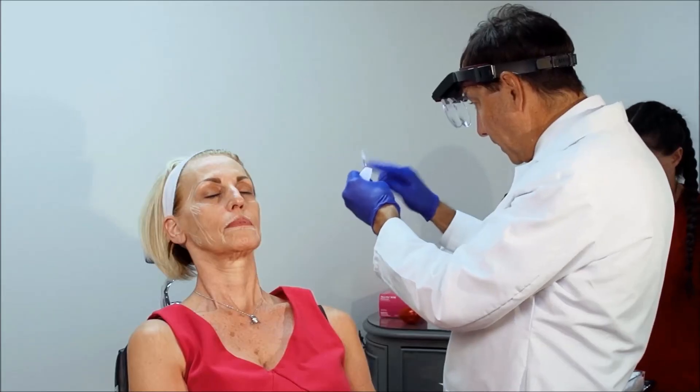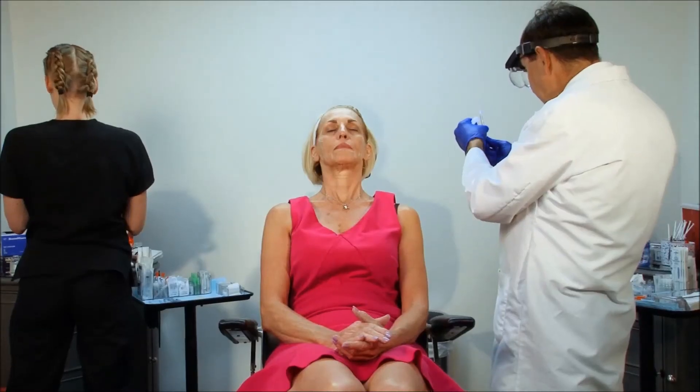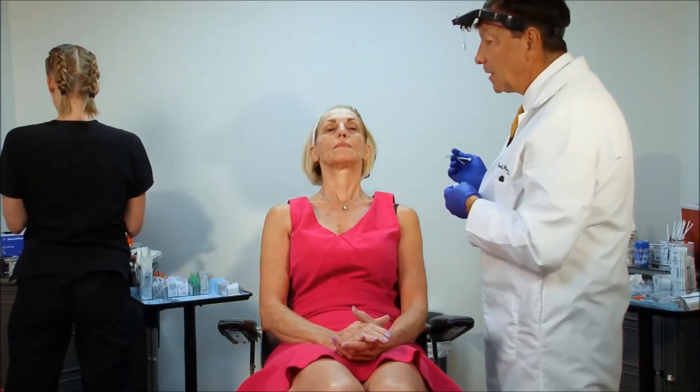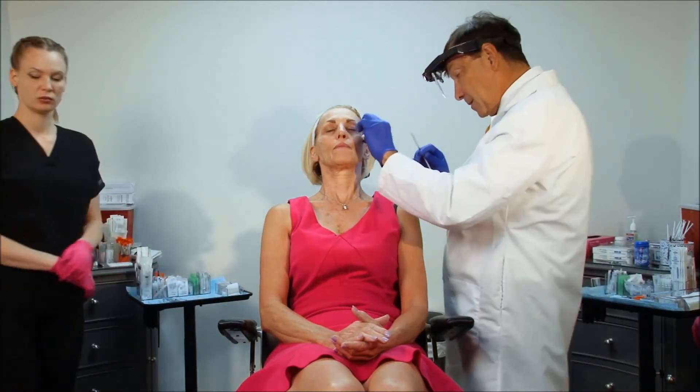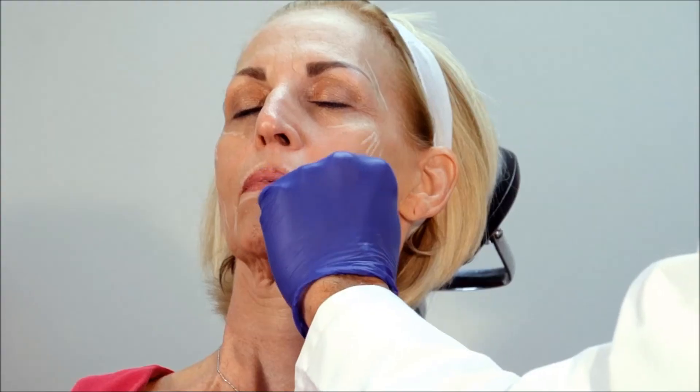The reason we do it with lidocaine with epinephrine is the epinephrine causes some vasoconstriction, which lessens the chance of bruising. We're going to be using a microcannula technique today. We're going to pick out a few tactical insertion points where we'll be delivering both the filler and the threads.